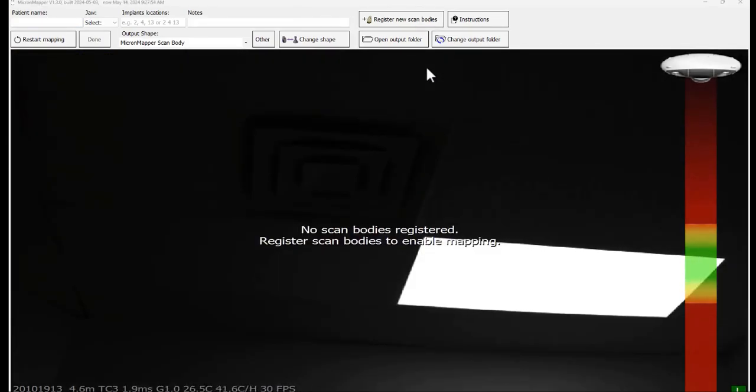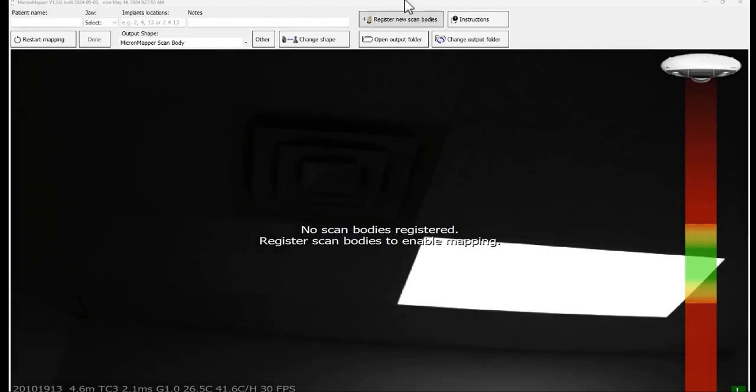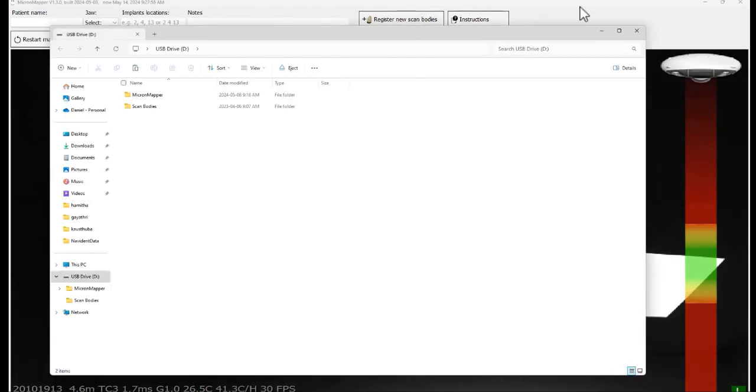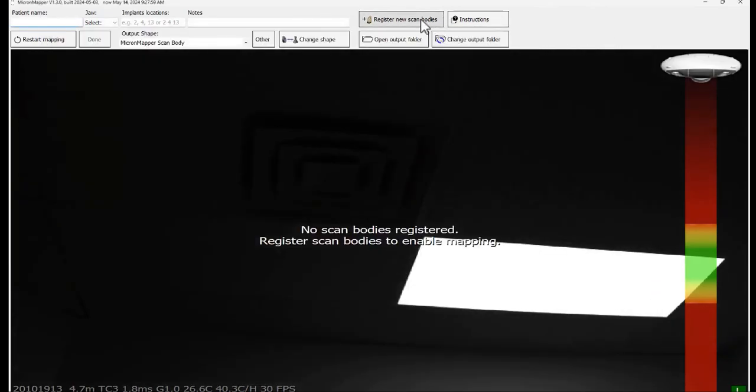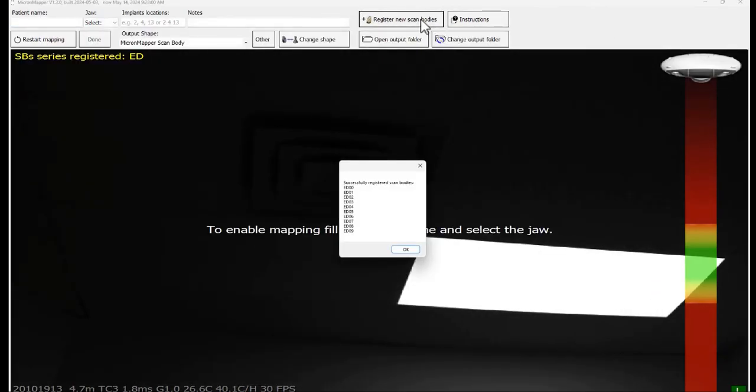To register your scan bodies, you need to insert the USB device which came along with the scan bodies and click on register new scan bodies. A pop-up will come up stating that the scan bodies are successfully registered. Click OK.